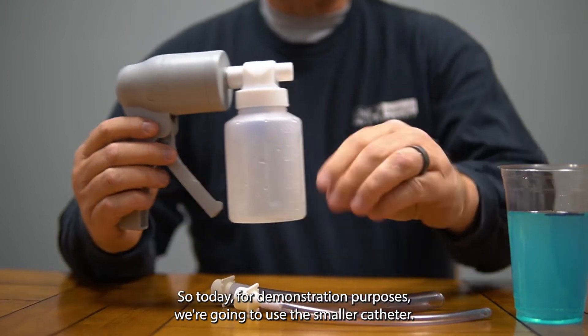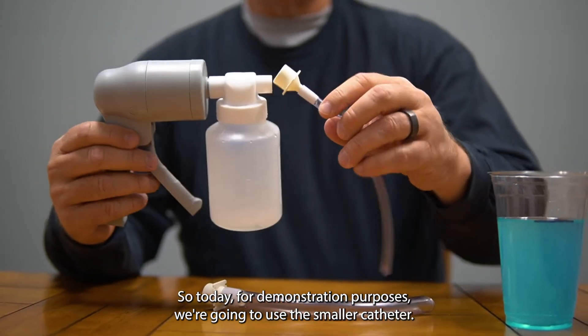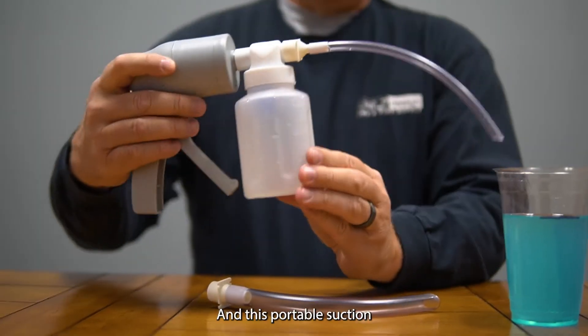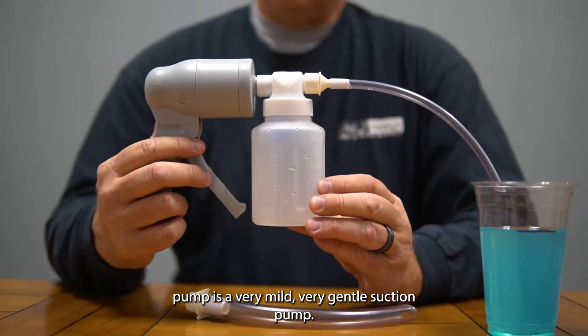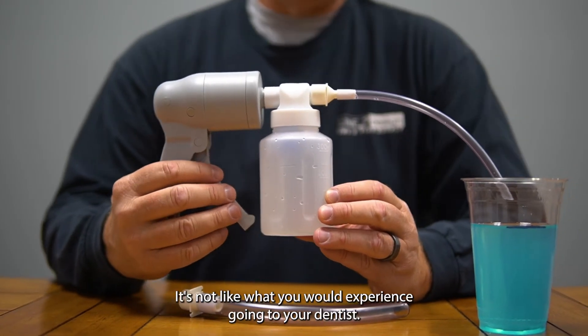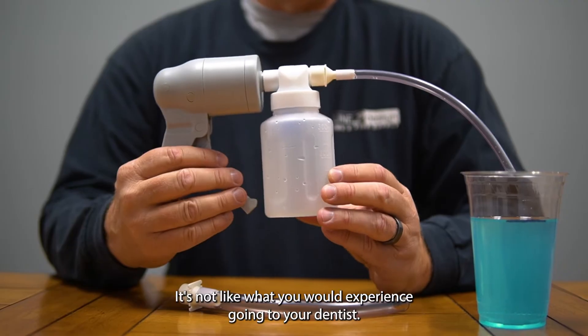For demonstration purposes, we're going to use the smaller catheter. It just slides right on, nice and tight. This portable suction pump is a very mild, very gentle suction pump — it's not like what you would experience going to your dentist.